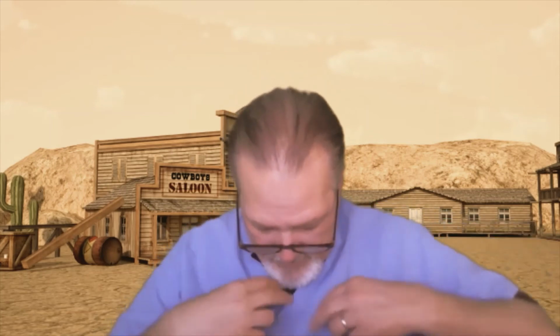And so when you make these linen packs, if you wrap them too tightly, you're trapping air inside and you're not letting the steam sterilant get into all of the surfaces. There's a lot of surfaces inside of a linen. Just how many surfaces do you think there are in the weave of this shirt? Okay.